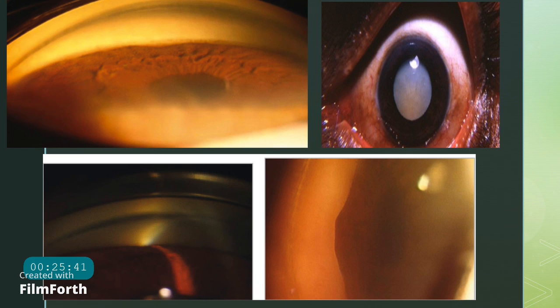So these are the pictures. This is the lens intumescence, intumescent lens. This might actually close the angle. Then synechiae formation. Here you can see this is a narrow entry. There is no Schwalbe's line which is seen. Similarly here, you can see this pigmentation which is present, and the iris is also not at the same level, because here you can see some amount of synechiae formation.